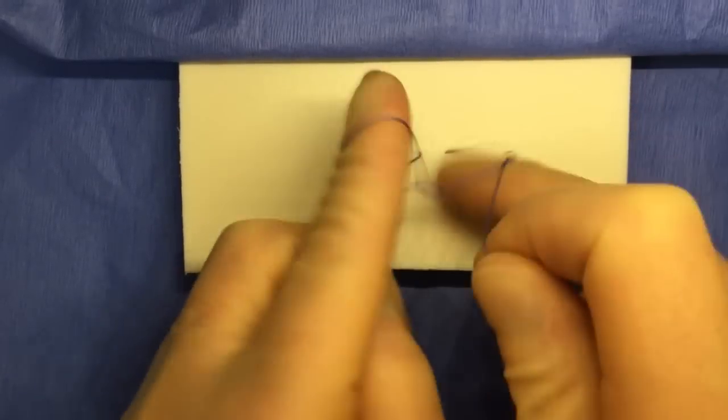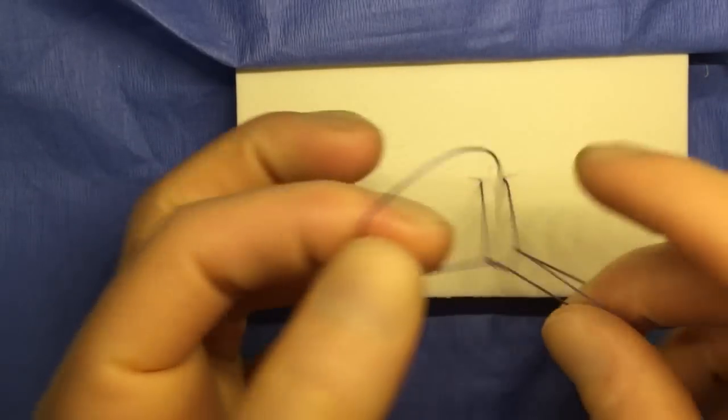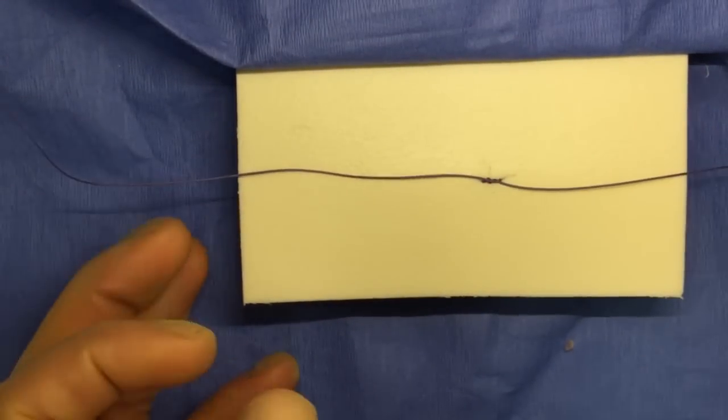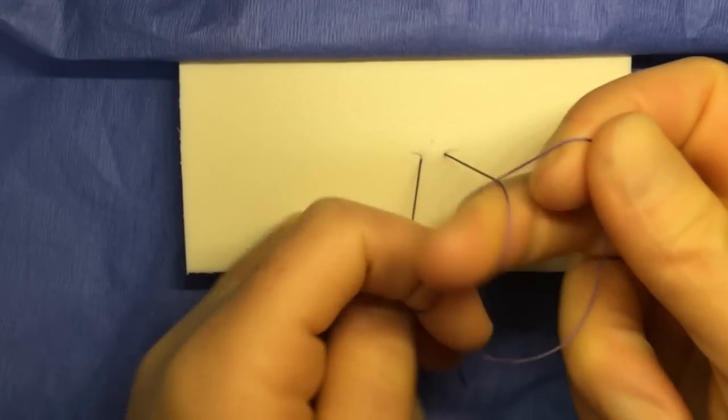And then, full speed. Again, full speed knot. And that completes the one-handed surgeon's knot.